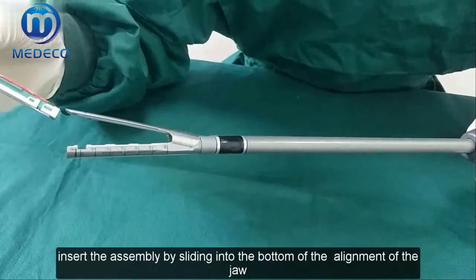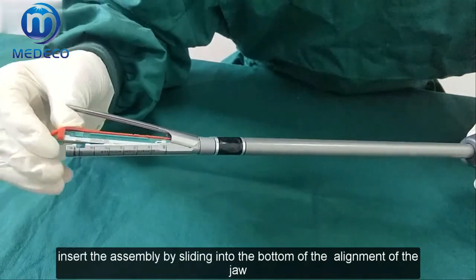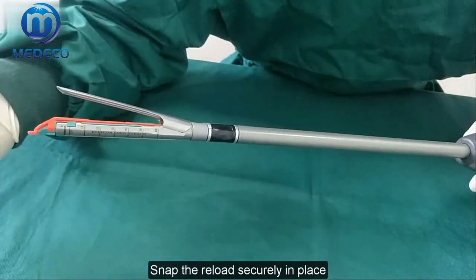Step 1: Loading the instrument. Insert the assembly by sliding it into the bottom of the alignment of the jaw. Snap the reload securely in place.